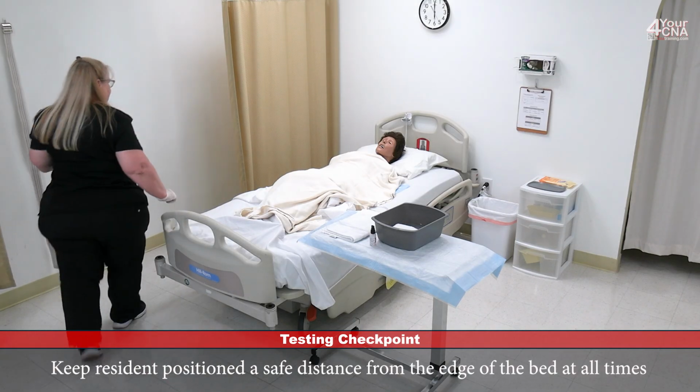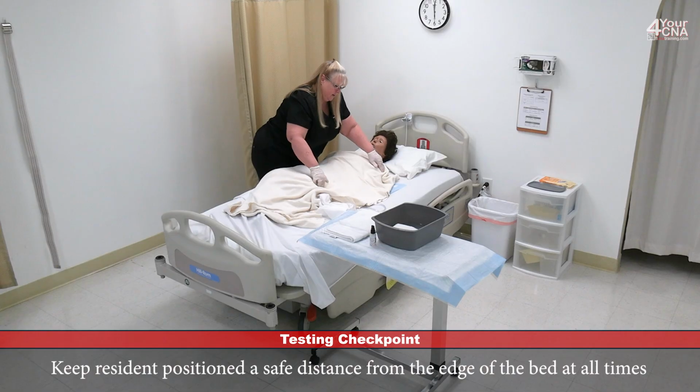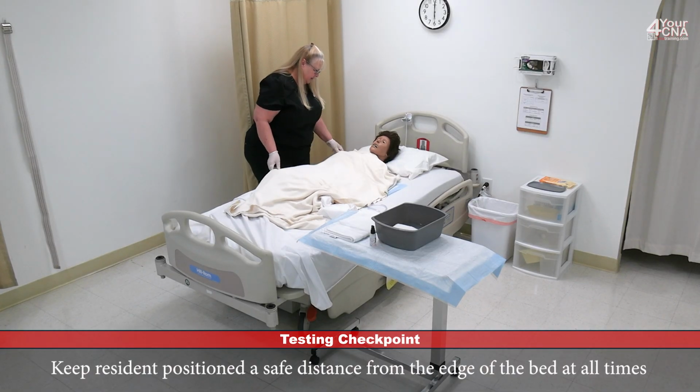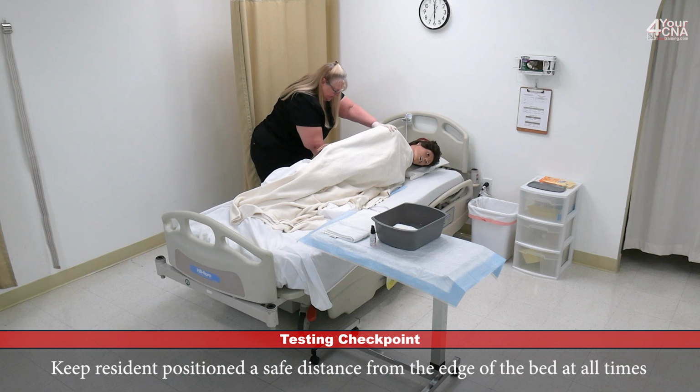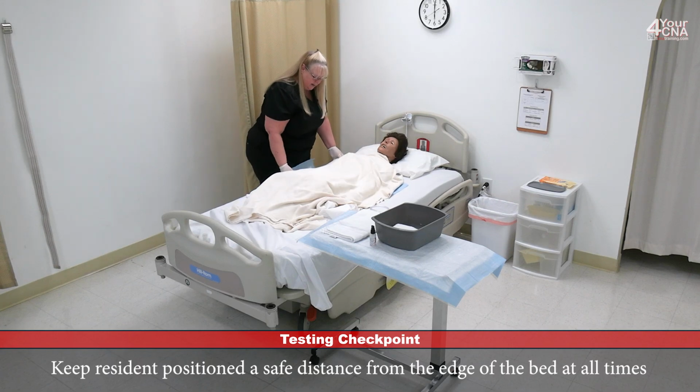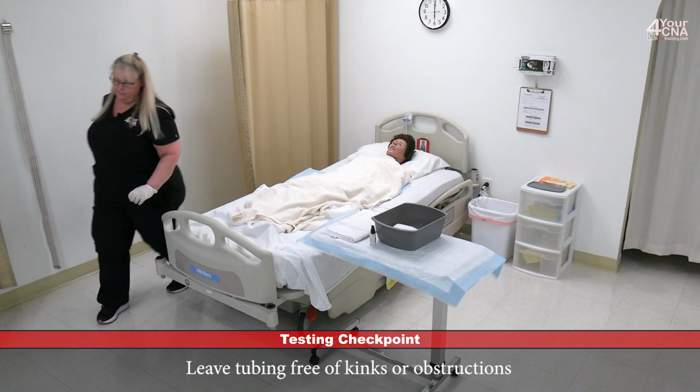Okay, Miss Jones, we're going to repeat the process. Go ahead and scoot toward me. And we're going to roll you onto your left side. 1, 2, 3. And I'll smooth that chucks out underneath the patient. Come on back onto your back. And then scoot to the middle. Now we can begin the cleaning.